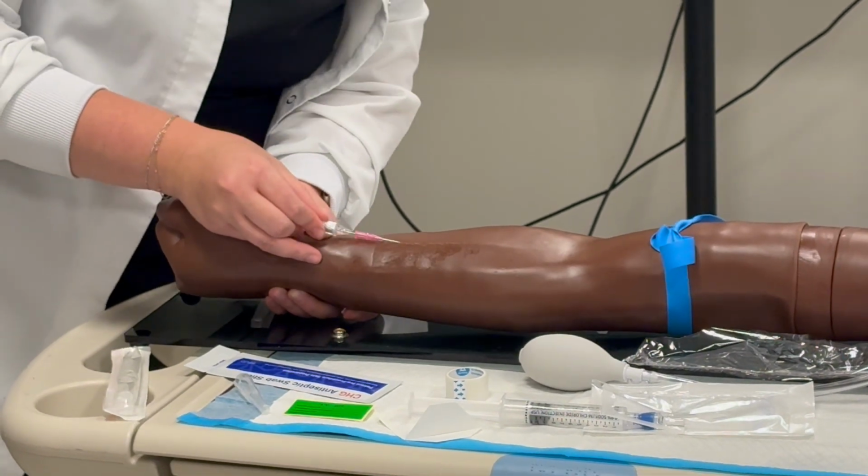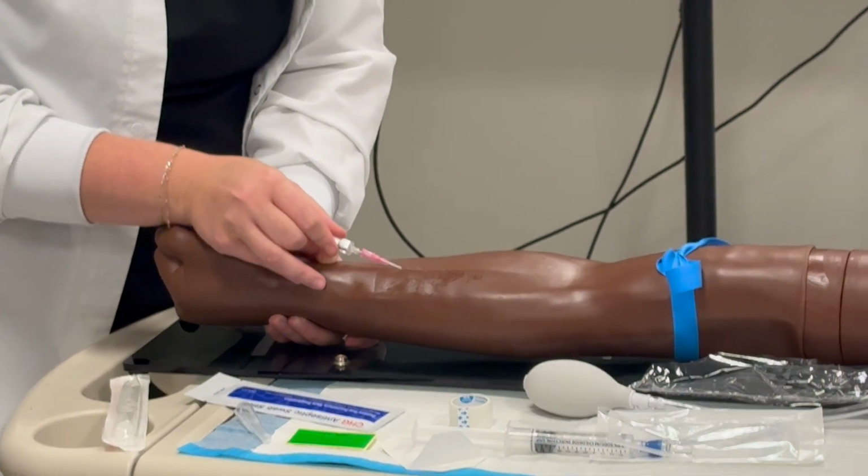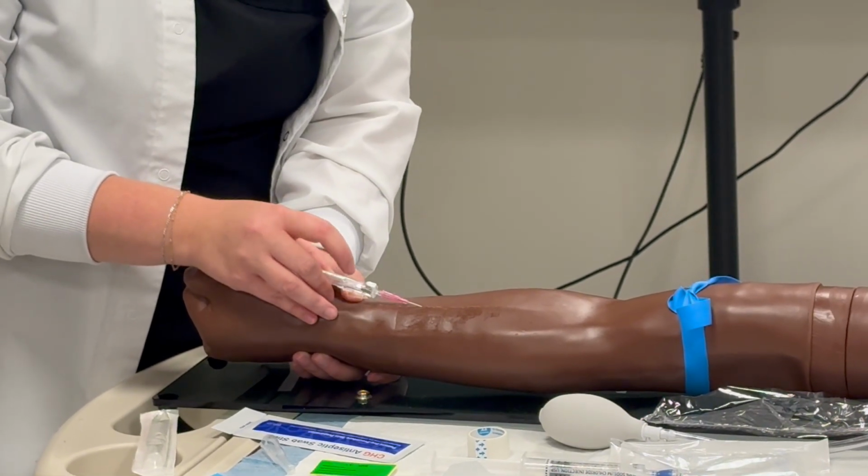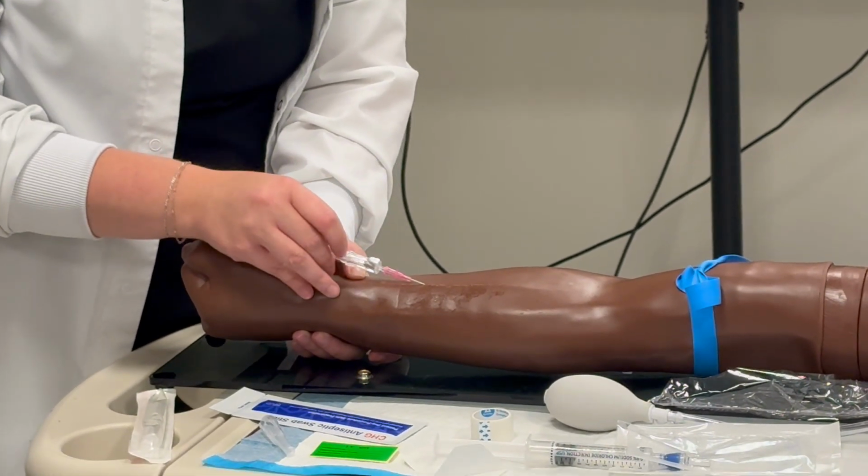Where you're looking for blood return is in the chamber of the IV. Right, it's here, further back. Oh, I guess right here. It'll come in here too. Yes. I look for it here as well.